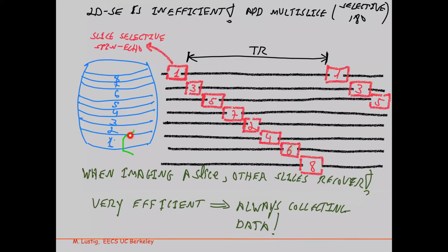The other thing is the 180 often needs to be a little bit wider. So even when I choose a 180, it's usually a little bit wider, because I want to have a 180 angle even on the transition. Okay, so that can definitely cause interference between slices. So this is why the order is 1, 3, 5, 7, 2, 4, 6, 8. Okay. So by the time I reach slice 2, a lot of time has passed.